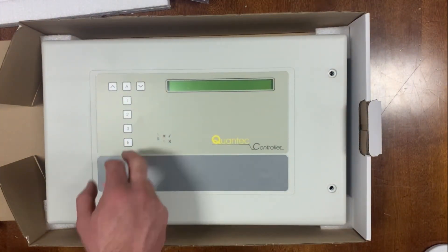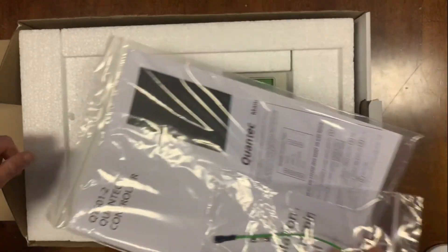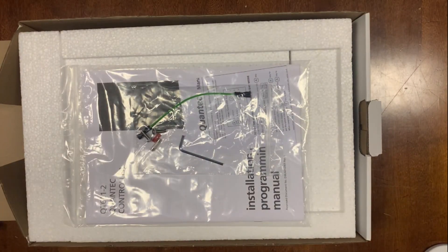I'll do a separate video on that, but I just wanted to show you today what you're getting in the box. That's the Quantec nurse call panel.